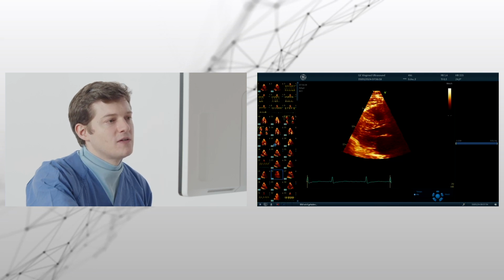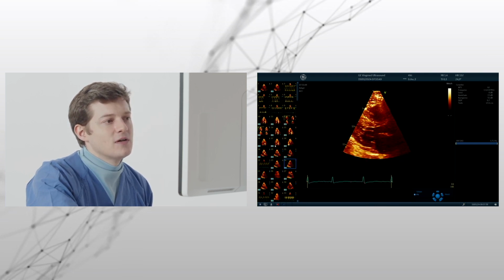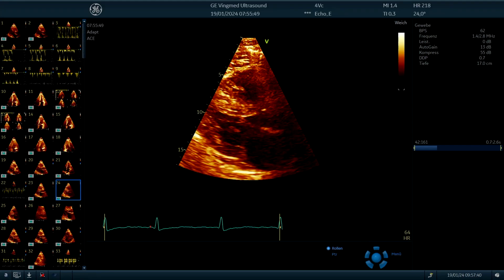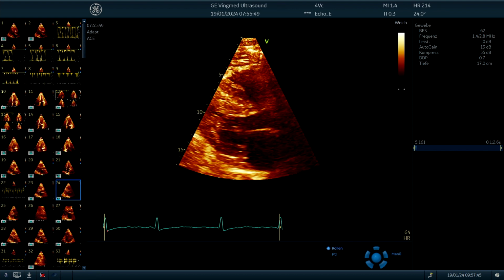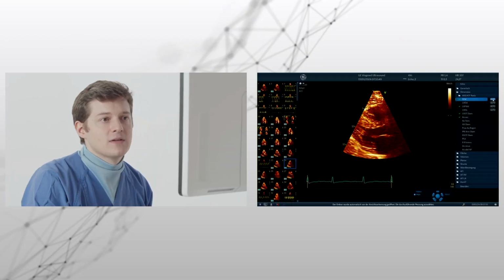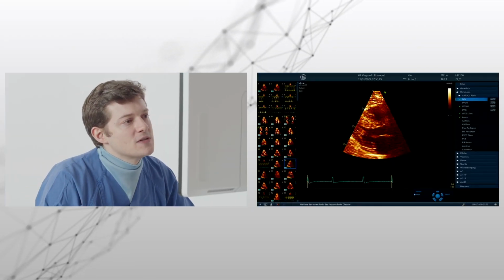because what we additionally want to measure, of course, is, and here we're already too far, the left ventricular wall thickness. And here we need an optimal diastolic image, and it's not easy to scan this patient. So the mitral valve should be closed, and it should be really in end diastole. And we can try to measure the interventricular septum here, even though it's really hard.